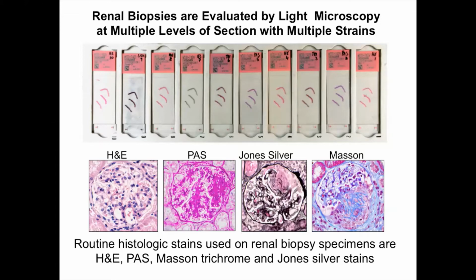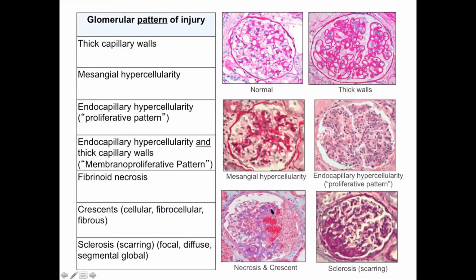In cases of crescent بيساعدنا إن إحنا يعني نتعرف مثل هني إن there is a crescent formation by the breakdown of the glomerular basement membrane. بيساعدنا إن إحنا نعرف إن there is مثلاً an MPGN pattern when we have the tram track duplication of the glomerular basement membrane. So we need those. Okay.